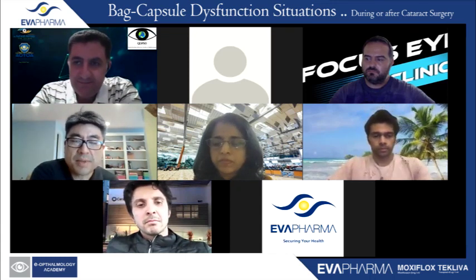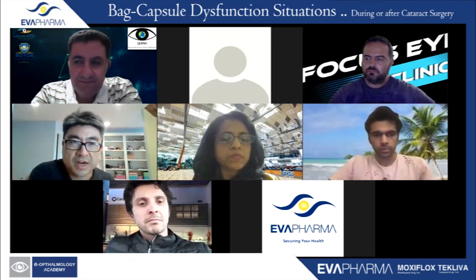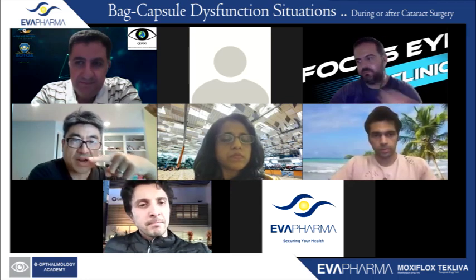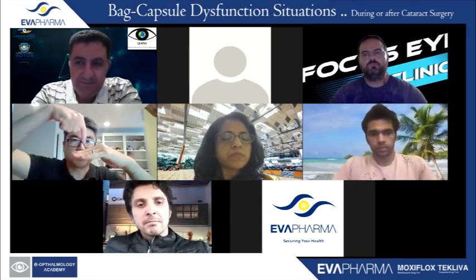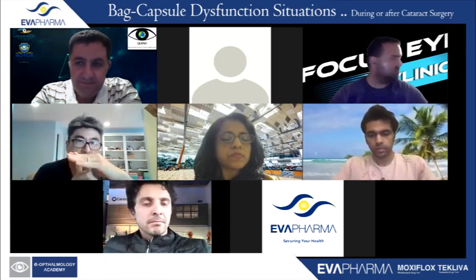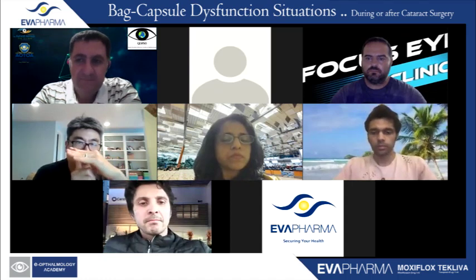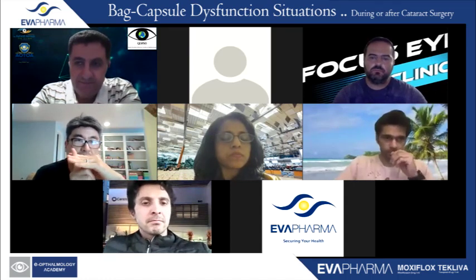So first comment is, if you don't have a good tunnel through the sclera before you penetrate into the vitreous space, what will happen is, if this is a sclera and you go in with a needle like this, and then you make the little bulb, well then, naturally it's going to go up like this and it'll protrude through the conjunctiva.